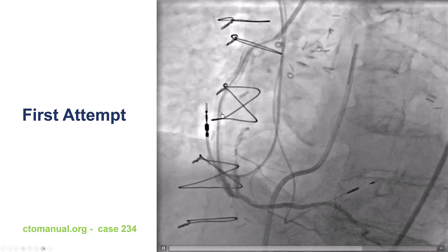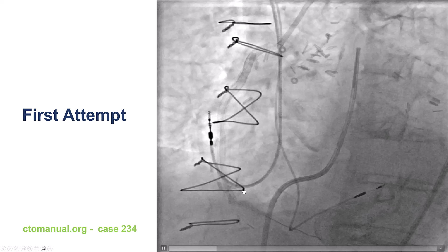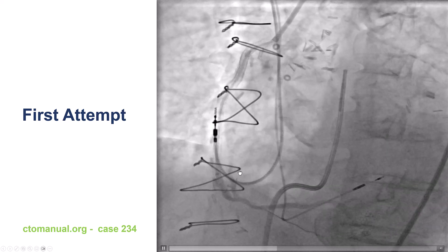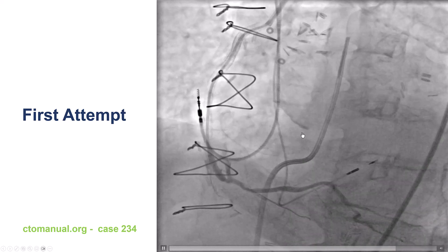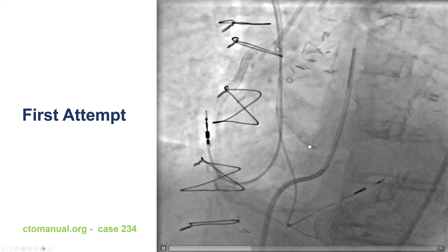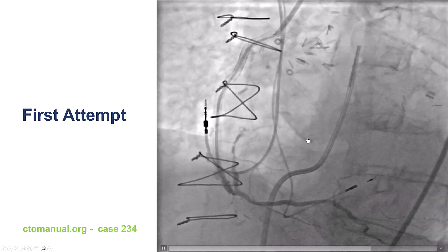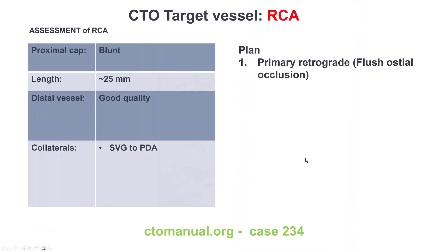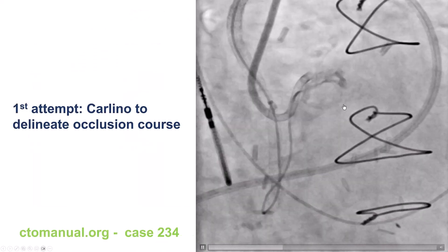From the first attempt, there is diffuse disease in the vein graft and some retrograde filling of the right coronary artery. It's a flush aortic ostial CTO with significant calcification in the aorta. Based on this, we decided to go for a primary retrograde approach.